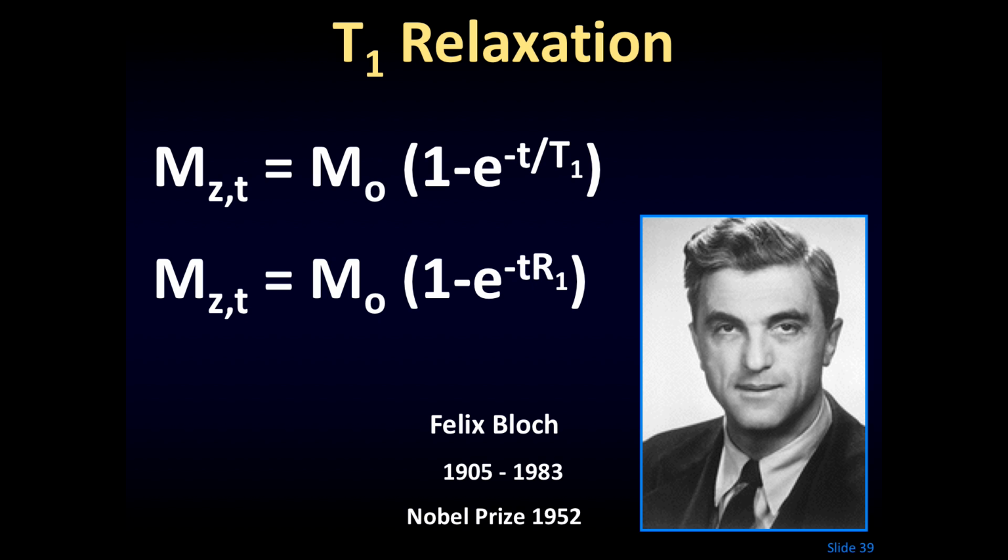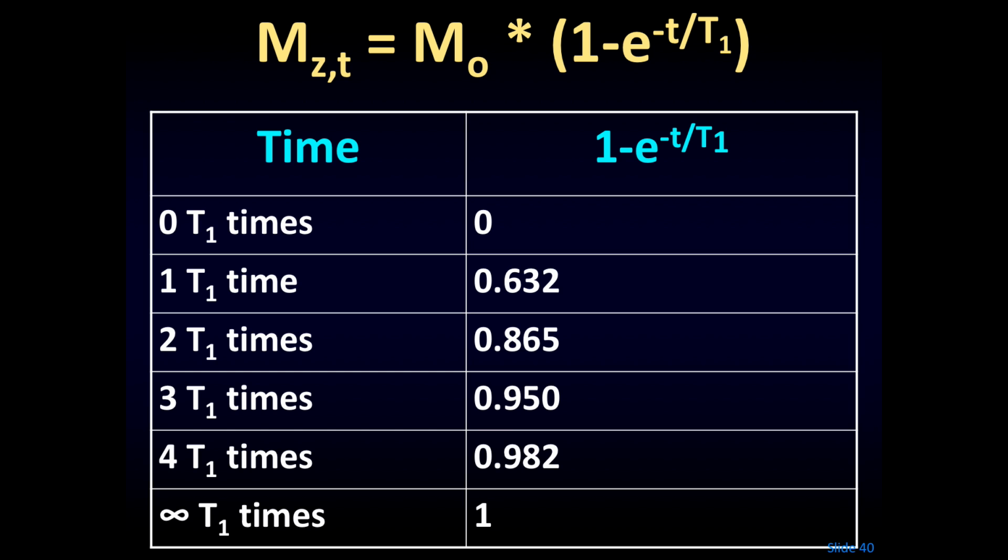equation immediately below. Now, for some of the people in this room, they immediately understand what this equation looks like. There's probably 3 of you out there. For most of you, this looks like mumbo jumbo. So let's take this equation and plug it into Excel. So here's the equation at the top in yellow, and all I did is ask, what if t, little t, is equal to 0? Or what if little t is equal to this thing called T1?